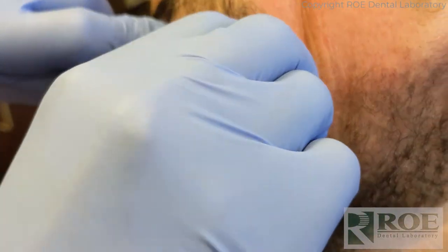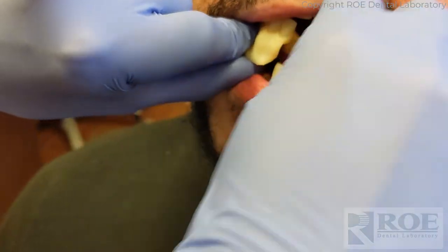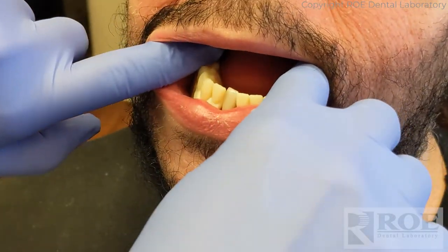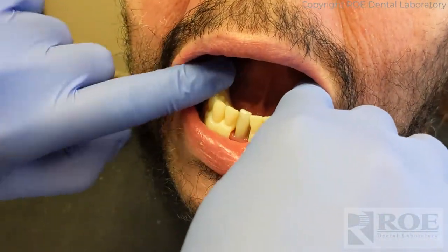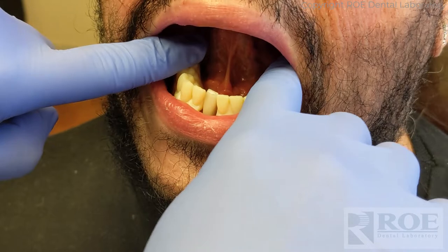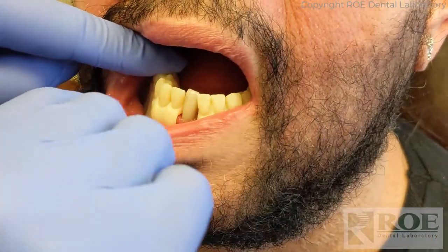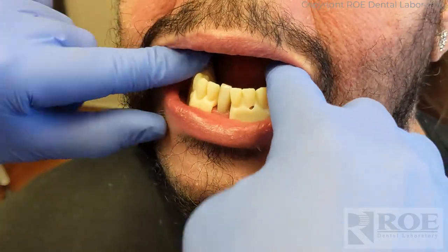This one has a lot bigger flange — I bet this is not very comfortable at all. It's like wearing a denture, but this basically simulates seating a denture. It does have one tooth in the anterior but it's really tissue-supported. How's that one feeling? Pretty good — just a slight... go ahead and lift your tongue. Not too bad. There could be a little bit of bounce on tissue and that's kind of expected. The flange is pretty long. Is it pinching anywhere in your lower vestibule? Okay, you pressed pretty hard on it too.